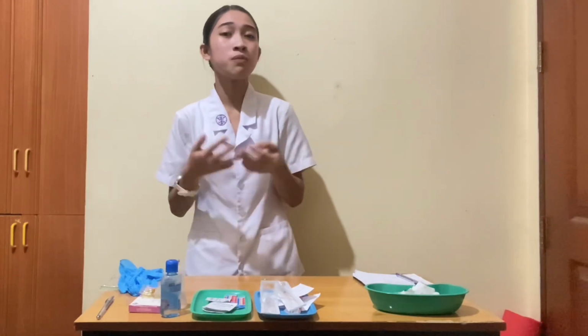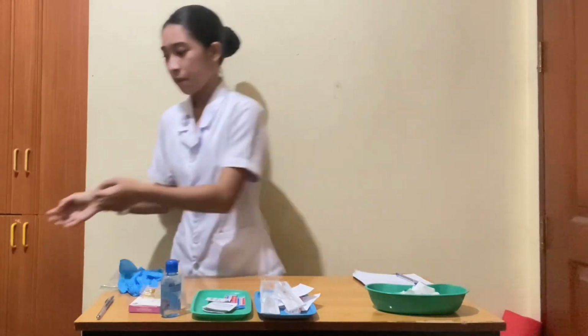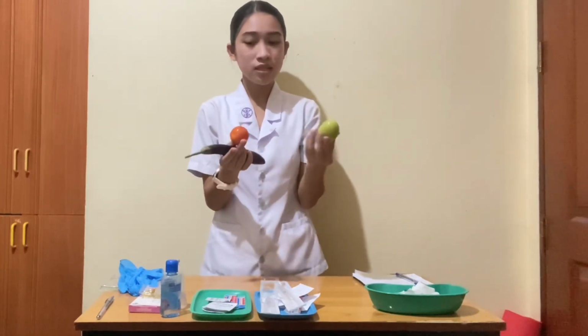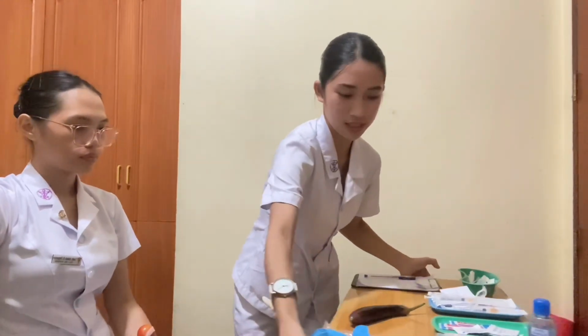Now that we are done preparing all the medication, let us proceed to administering it to the patient. Since it is not necessary for us to have a real patient, I'm just going to use vegetables like eggplant and this tomato. So I'm just going to proceed to the administering of the medication.